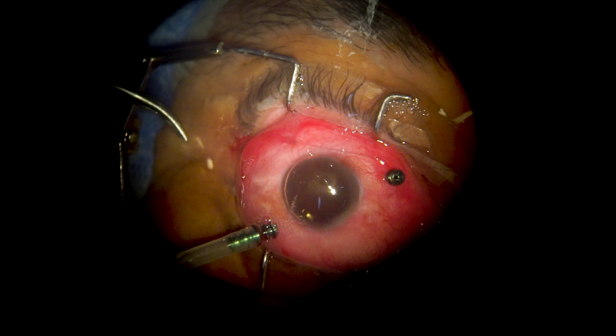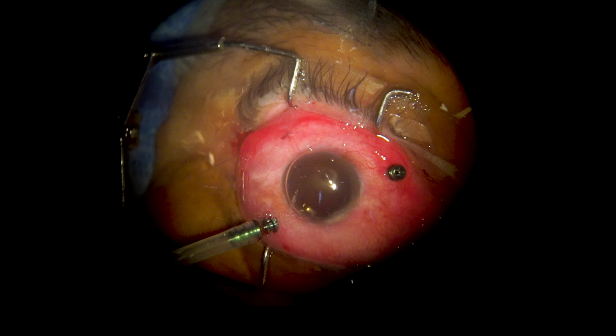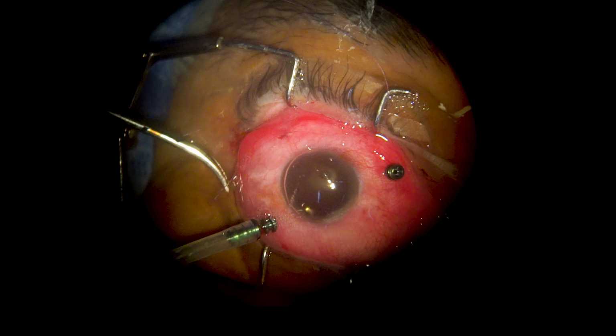AFX, air fluid exchange, was next, starting from the very periphery to avoid any slippage of liquid towards the subretinal space. It was a complete AFX, and SF6 gas was injected after this step of the procedure. We put a stitch at the conjunctiva by the end of the procedure. We appreciate your attention.